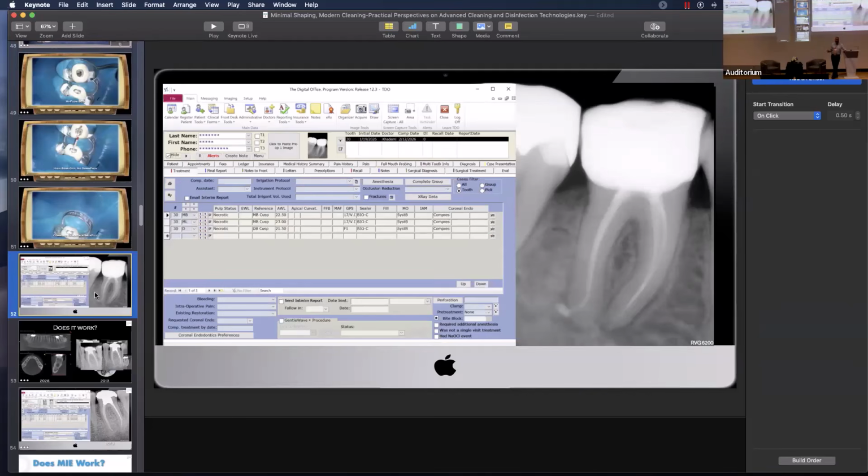We don't want to touch the files. I'll have cases where I can tell natively, just looking at the tooth, it's a 25, that's a cariously exposed tooth where we actually don't use files at all. I get length, run Gentle Wave, and the idea that you need to touch all the canal walls, that you need to cut dentin to clean the tooth, that's a question of endodontics 1.0. We're doing endodontics about 2.5 now, on our way to endodontics 3.0, which is completely non-instrumentation endodontics.